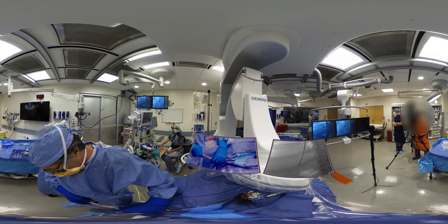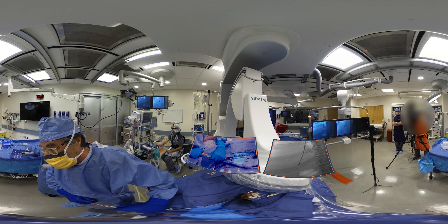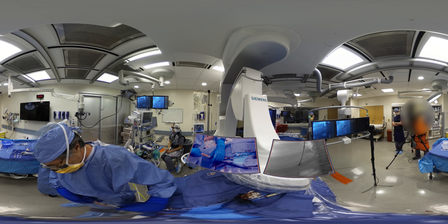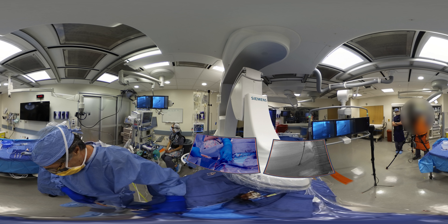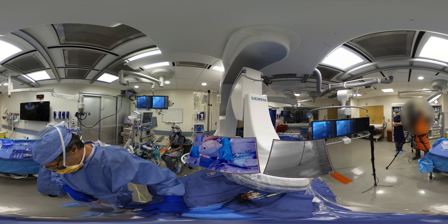If I want to inject, I'm going to take over the whole system again, relax the plunger, and then make a little puncture in case I wanted to see whether there was blood return or whether I'd sufficiently cleared it. You can see a small stain there, assuring me that the needle's free. Then reversing back — plunger, moving the hands back, grabbing the needle. So it's always in control. Now I'm going to push back with the thumb. The back hand is aspirating and also controlling rotation. There isn't much need for fluoroscopy at this point.